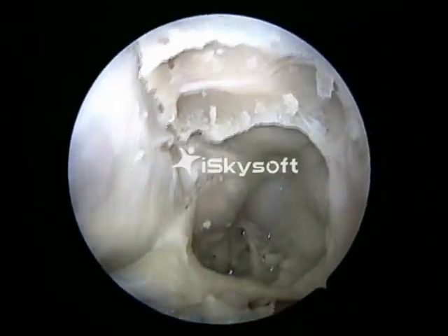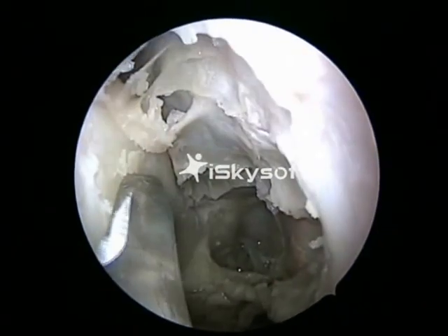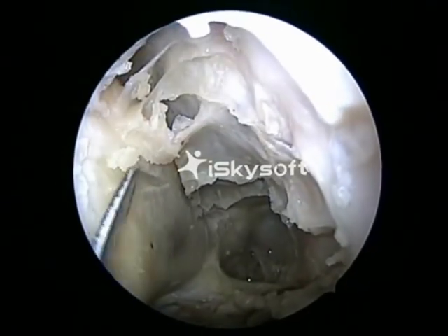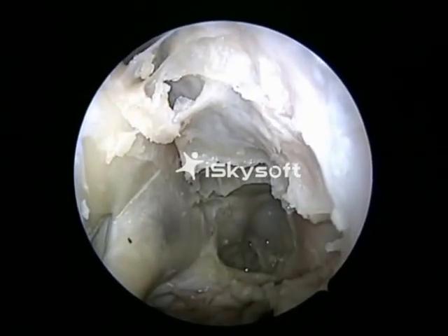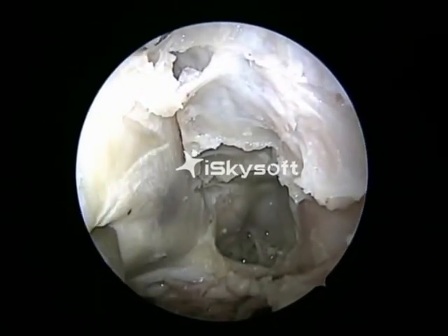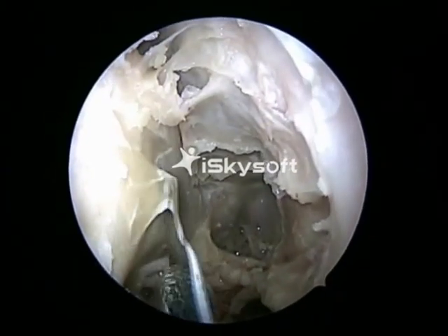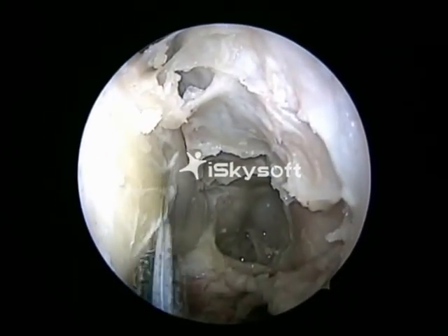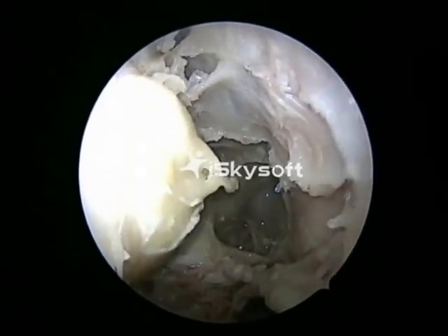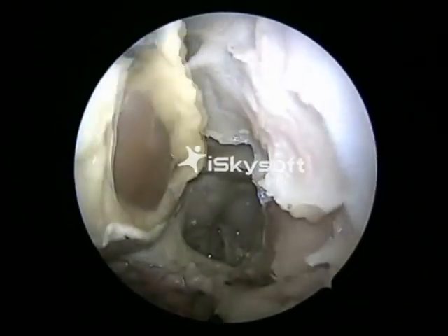And if we have to combine it with an orbital decompression, we make an incision on the orbital periosteum in an H-shaped manner. Care is taken not to injure the medial rectus muscle. And once we decompress the orbit, the fat prolapses medially, and this gives a retrogression of 5 millimeters. Now we can see the medial rectus muscle.